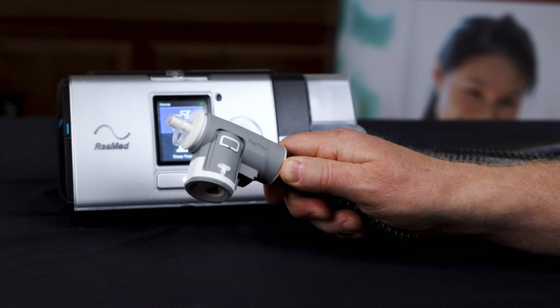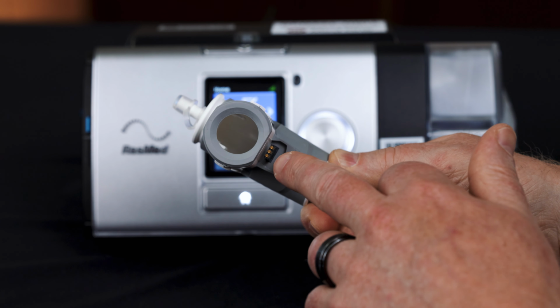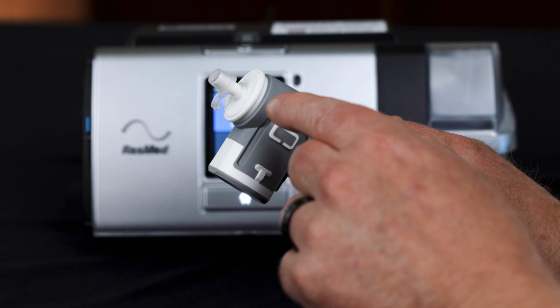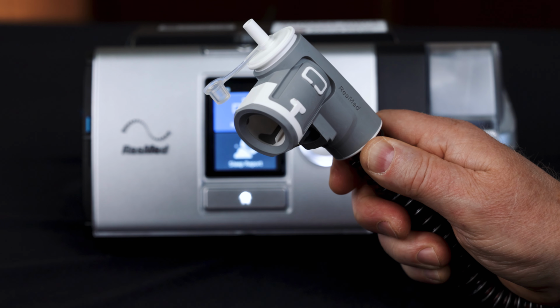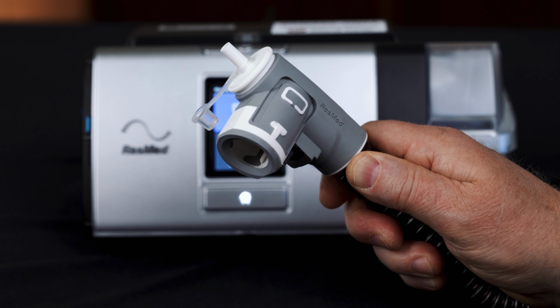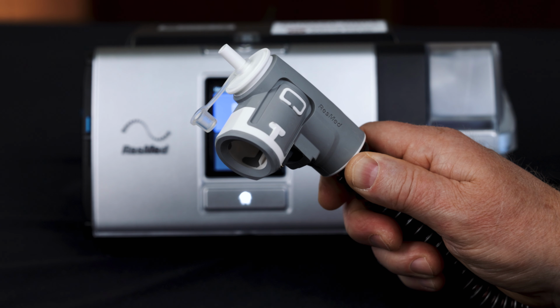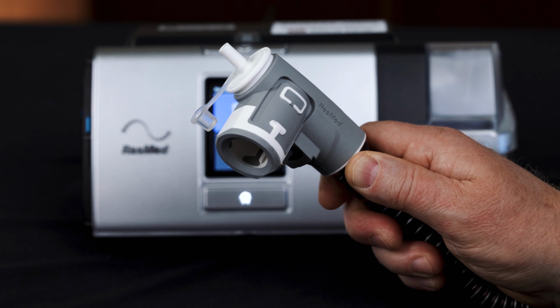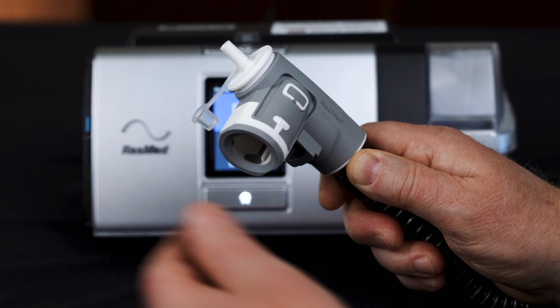Now I'm going to go over how to connect the manufacturer recommended ResMed circuit. You have your heated connector here, and then you also have an O2 bleed-in. So to use the O2 bleed-in, just remove the cap. Based on the physician's orders, based on liters per minute or FiO2, you place an O2 tubing on top of the O2 bleed-in and attach it to a flow meter on the wall or a concentrator. Please note, if you don't use the bleed-in, cap it.